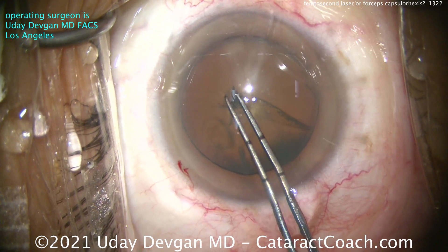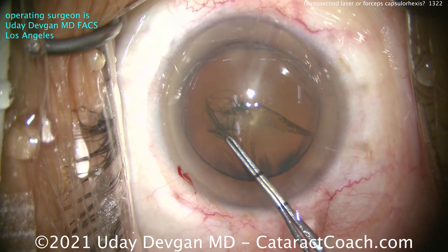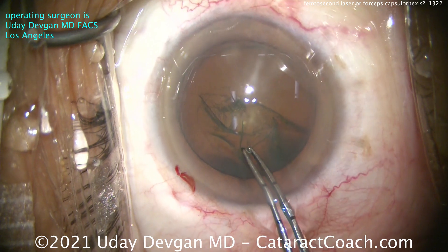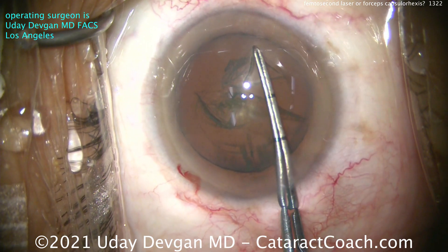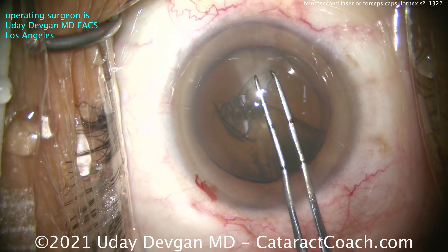So we're going to start poking in and we're tearing it. A capsulorrhexis — the word 'rex' in there means to tear. And so we're tearing a capsule opening that's 5 millimeters in diameter. You can see we're using my special forceps that have been marked off at the tip. The advantage of tearing it is the edges are really strong.